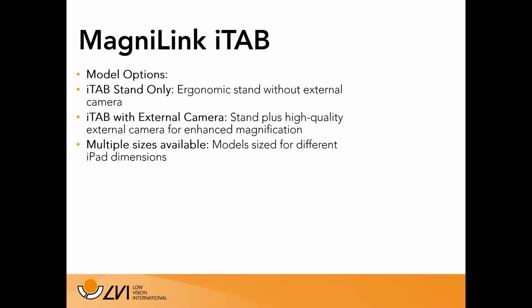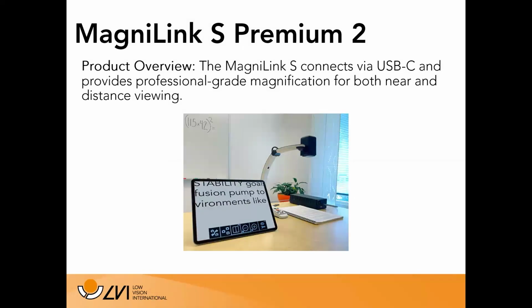The third thing to know about ordering an iTab is that the stand comes in multiple sizes for different iPad dimensions. Not every size iPad, but the iPad Pro, the 12.9-inch iPad Pro, we have a stand for that. And then we also have one for the 13-inch iPad Pro. We have a stand for the 11-inch iPad Pro, which will also fit the 11-inch iPad Air.